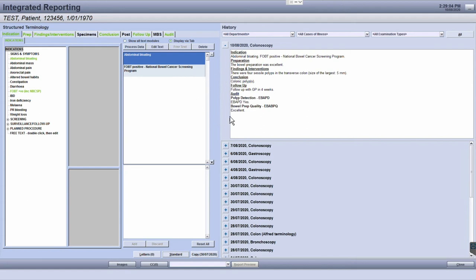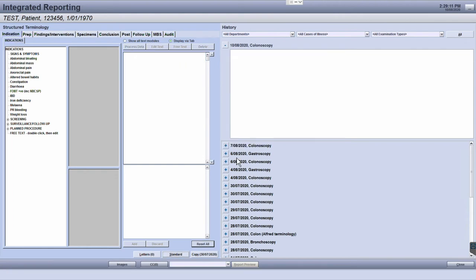To clear any existing text, click the reset all button. Now you have a blank template to start populating your report.